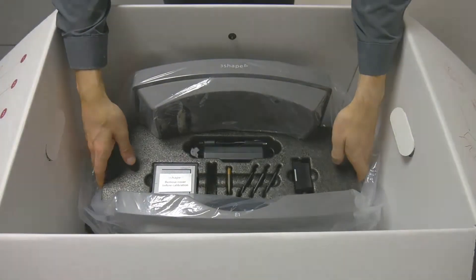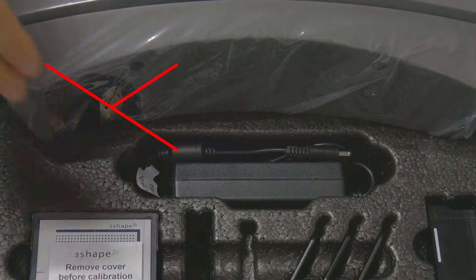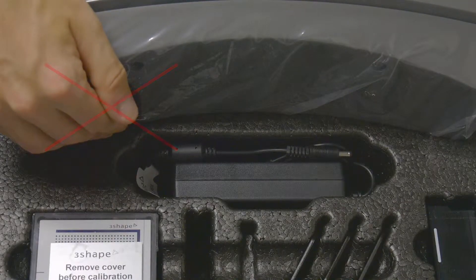When removing the lowest insert, be aware not to touch the upper part of the scanner, where the camera and other sensitive electronics reside.